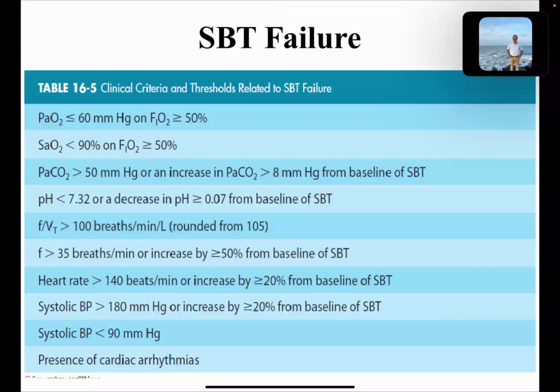One thing I want to mention here. In neurological patients, PaCO2 is very important. If the carbon dioxide level increases in the blood, that has a direct effect on the intracranial pressure, so that can rise. So PaCO2 is a very important parameter. To detect the PaCO2, actually you have to do an ABG. ABG in ICU patients is usually done twice only, in the morning and the evening. But there is one more non-invasive method to estimate the PaCO2, which is EtCO2. EtCO2 is the end-tidal carbon dioxide concentration. This is a small probe attached within the endotracheal tube with the ventilator, and in the ventilator you will see the EtCO2 graph, and from the EtCO2 graph you can estimate the PaCO2. So this non-invasive method of PaCO2 is used mostly in neurological patients.